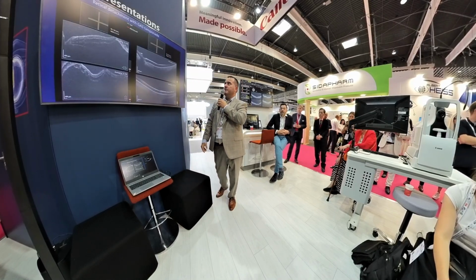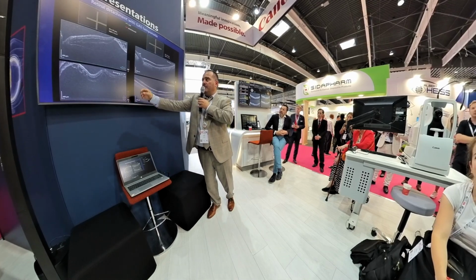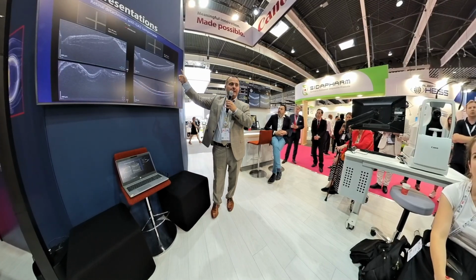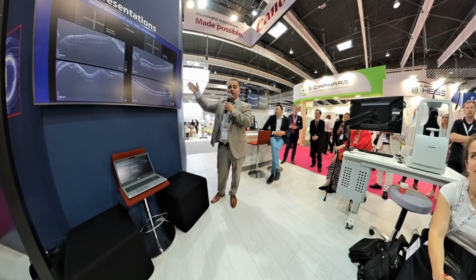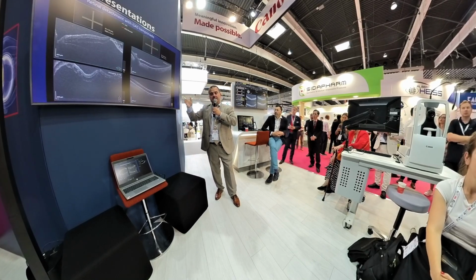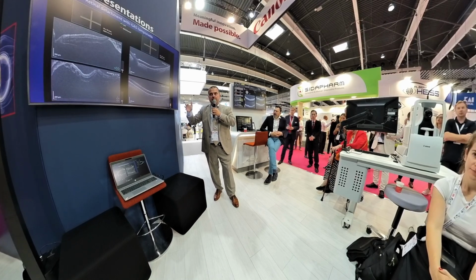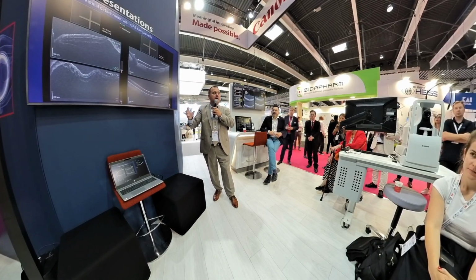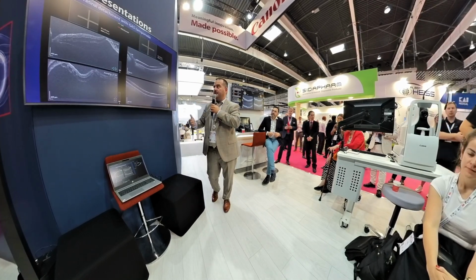Another case of retinal detachment, obviously preoperatively, and this is imaging through gas. So not only macular holes, but retinal detachments which were treated with gas tamponade can be seen on the first day with OCT without any posturing and without any fancy attachments on the OCT in order to achieve imaging through gas.